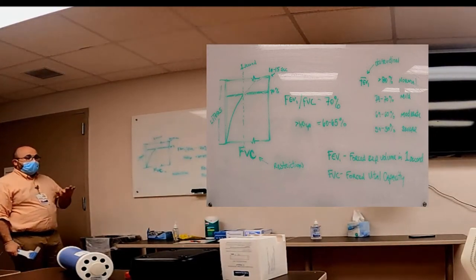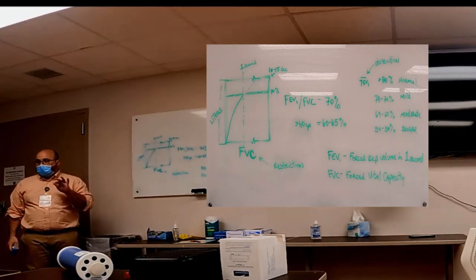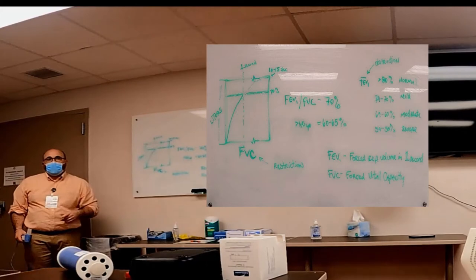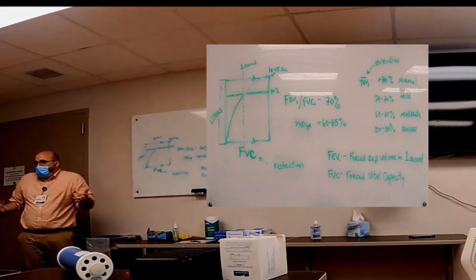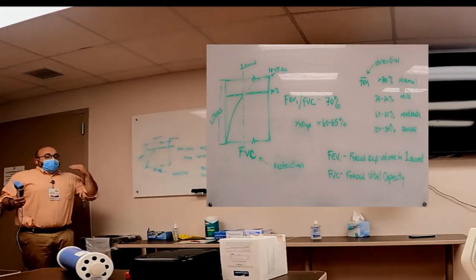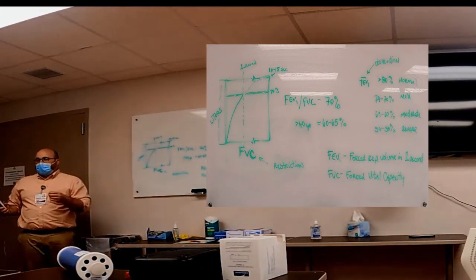If you go through this appropriately with them, they should have reproducible, and I'll talk about this a lot, reproducible forced vital capacity. So if I have you do three of them, they should all be pretty close to the same. They shouldn't be different. If you're going all the way until you're full and you fully exhale, it should be the same.